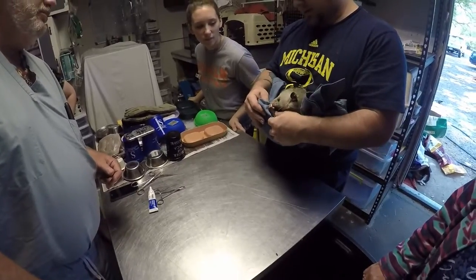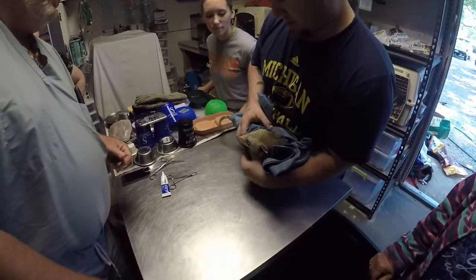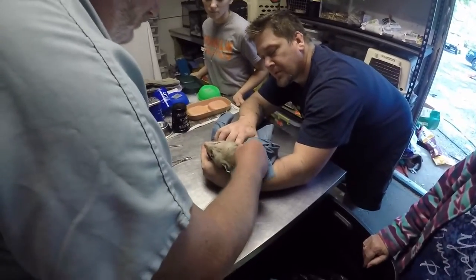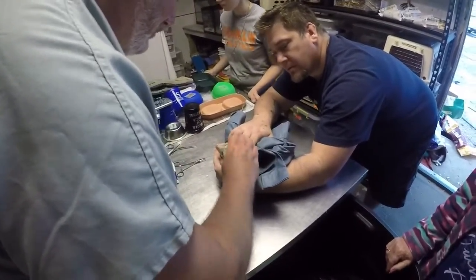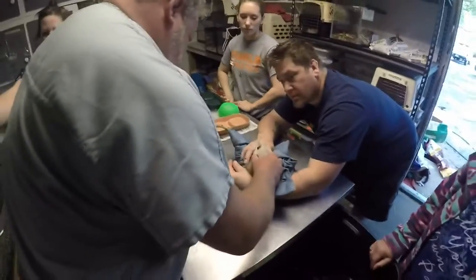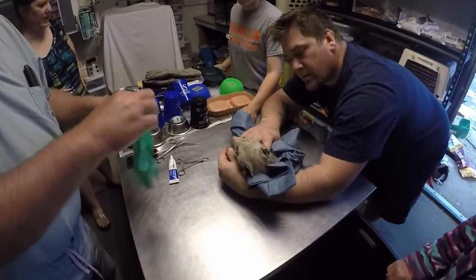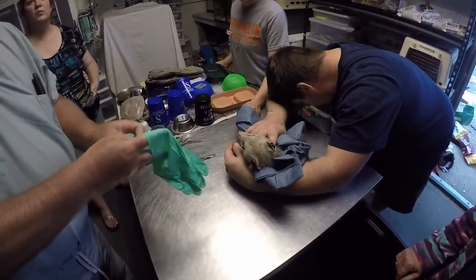We can't stay in long, I remember, but she knows it's come through. There's discharge in the ears. Gloves? There's more gloves. I got more gloves behind you. There you go. Ask and ye shall receive.